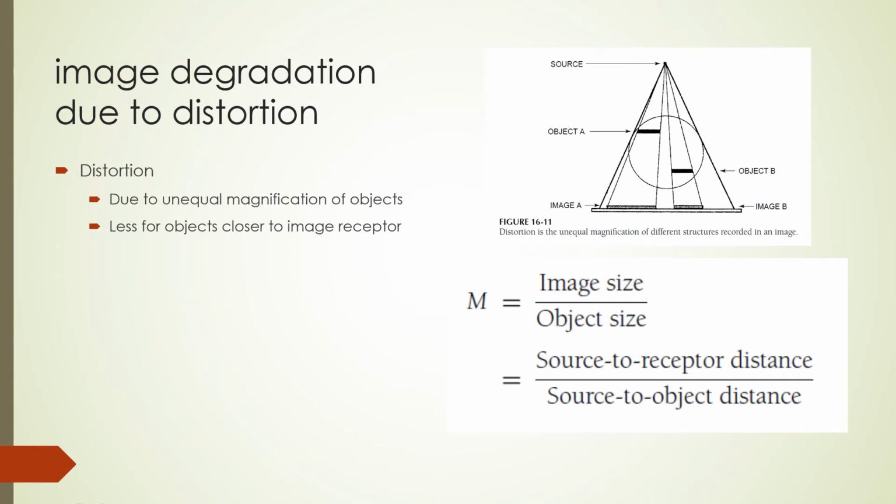Image distortion is caused by unequal magnification of various structures in the image. In radiography, for example, structures near the intensifying screens are magnified less than those farthest away, as shown in this figure. You can use these magnification differences to gain a perspective of depth among different structures in an image. The same formula for magnification applies in each case.